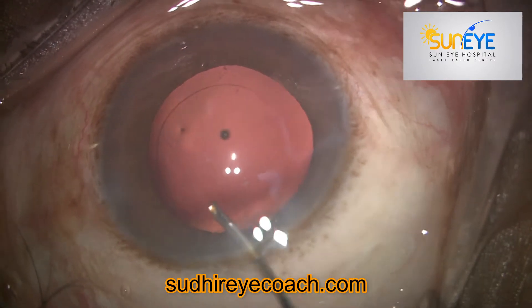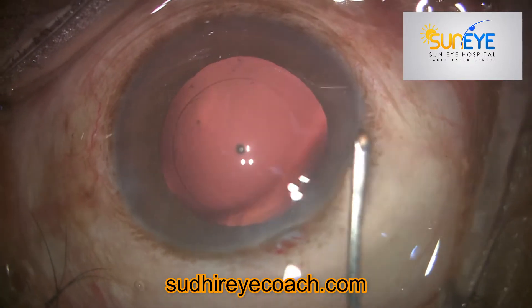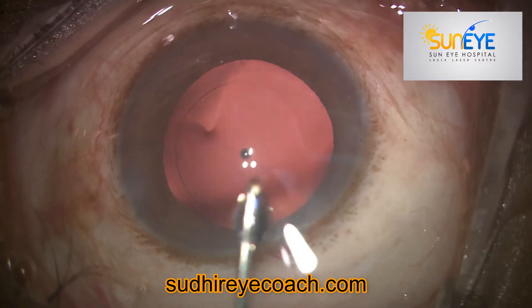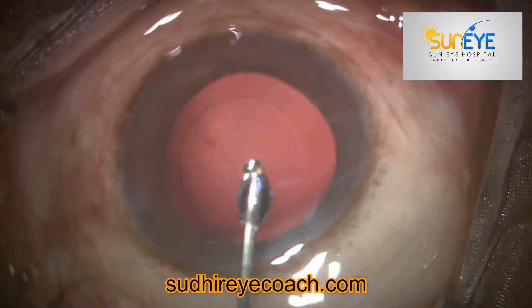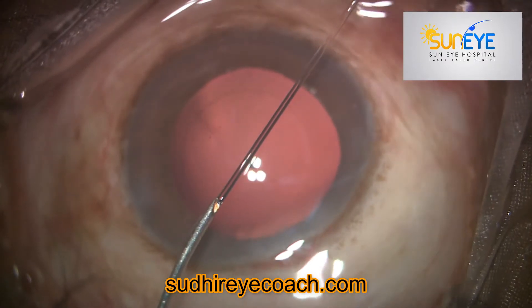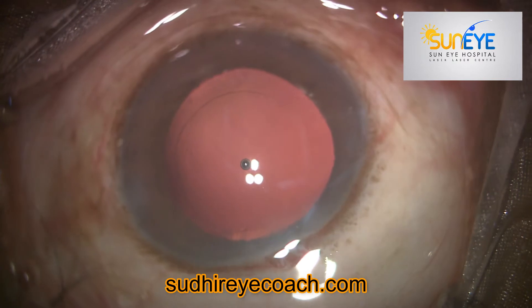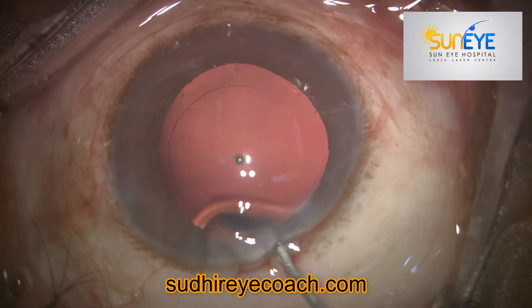Do not go underneath the anterior capsule, as that may create complications. This is simply a 26-gauge curved cannula with a build-up tip, and the pressure should be gentle. It is a very simple procedure and you can try it. Thank you.